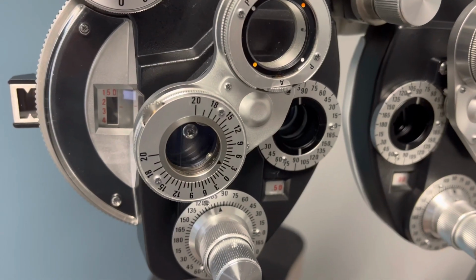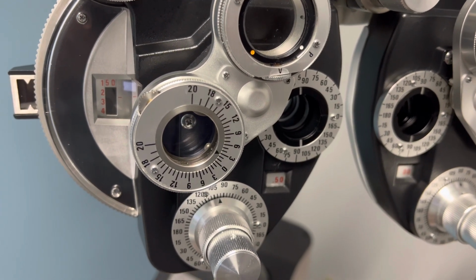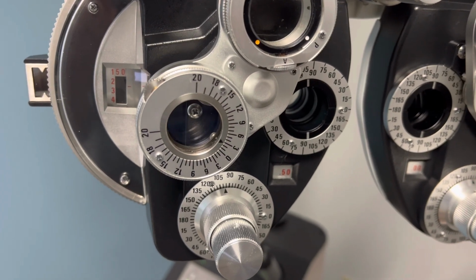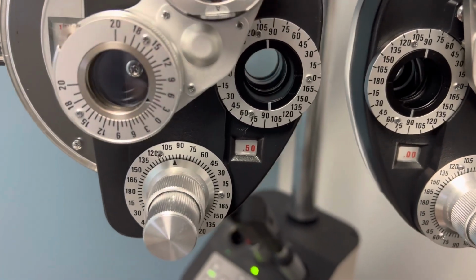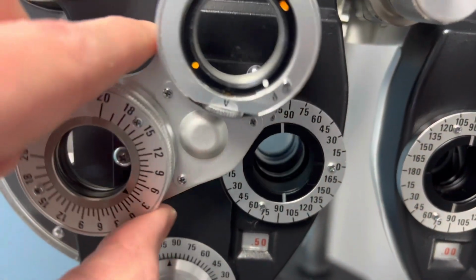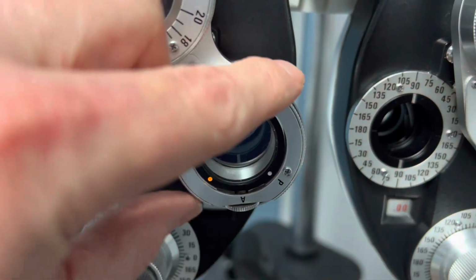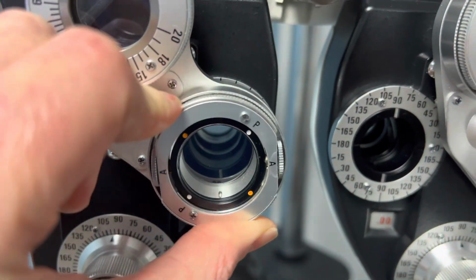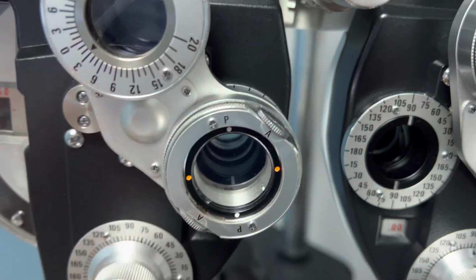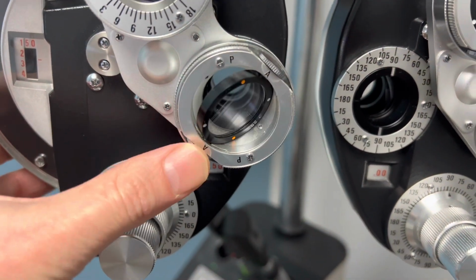So once we've figured out how much nearsighted correction you need, you may feel like the letters still look a little bit fuzzy. So that's where we're going to come down here, and we're going to work on your astigmatism power. So what we're going to do is see if you need any extra astigmatism power. So I'm going to rotate this dial here, and I am going to ask you which is better, 1 or 2.